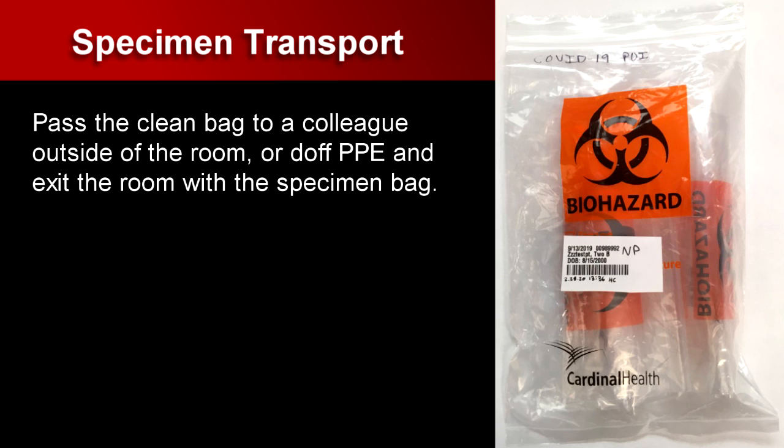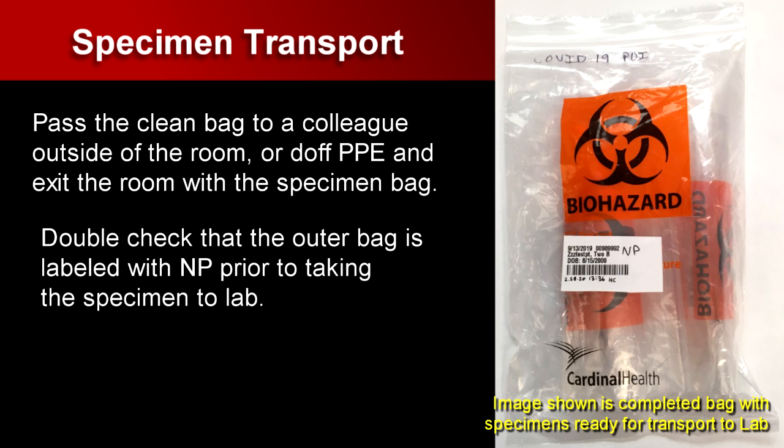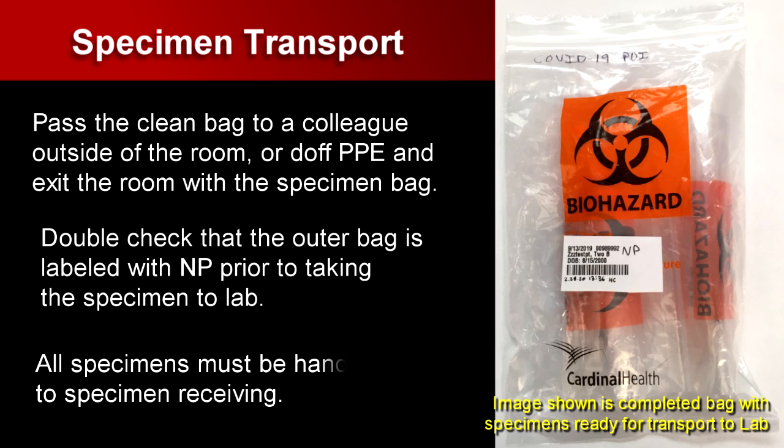Pass the clean bag to a colleague outside of the room or doff PPE and exit the room with the specimen bag. Double check that the outer bag is labeled with NP prior to taking the specimen to the lab. All specimens must be hand-delivered to specimen receiving.